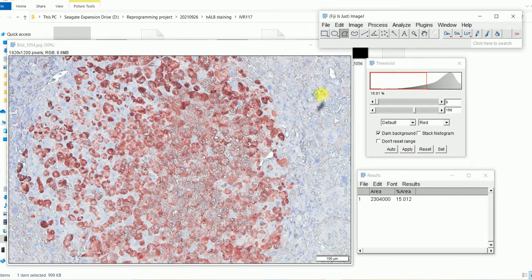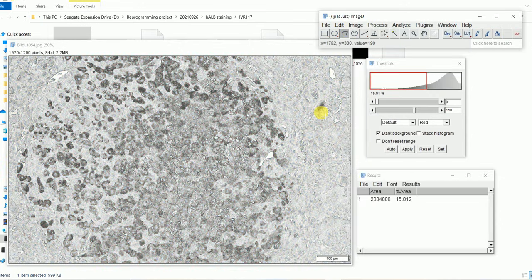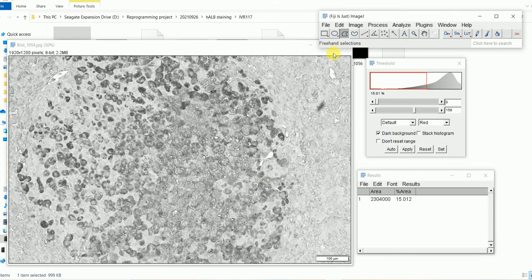Okay, look here, this is the black thing. This is some unwanted black thing that came from your staining. And when I convert this image into an 8-bit image, it also appears black. We don't need to set measurements, but it's already set. So we can check area and area fraction, both of these are checked, and we're just going to press OK.